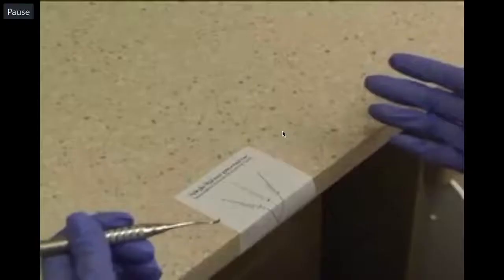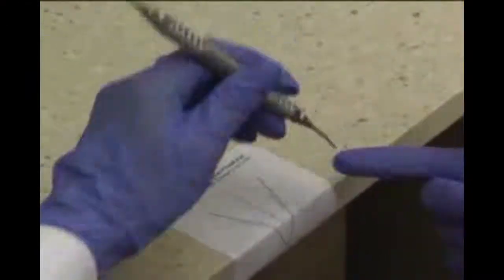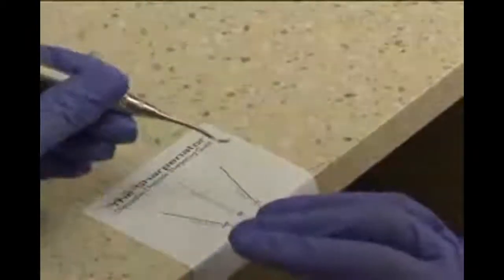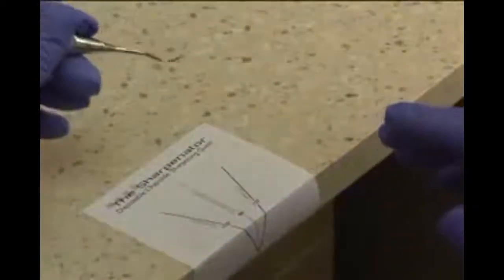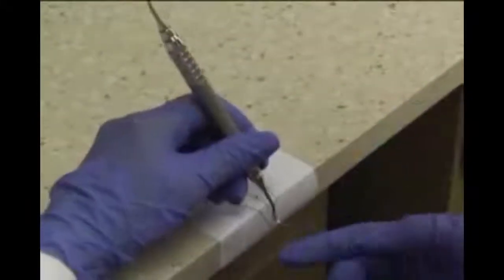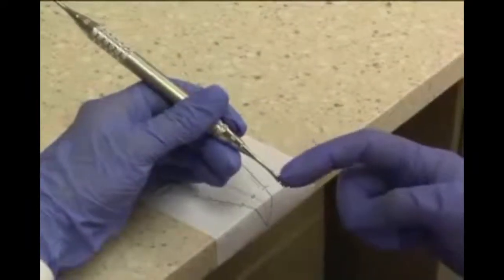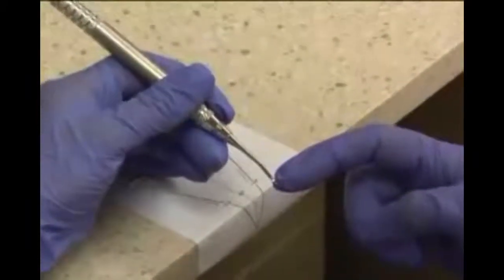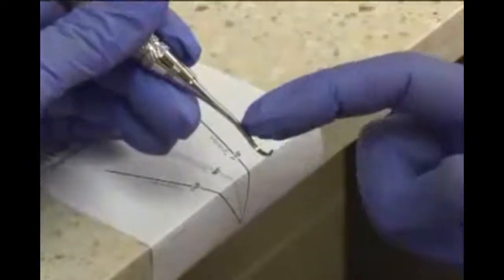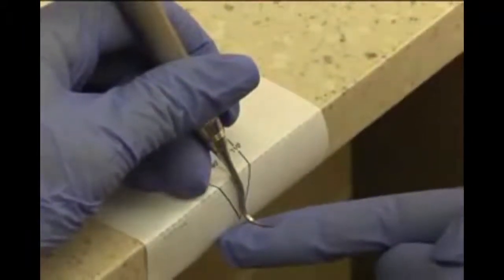So we are going to start with the anterior sickle. I'm going to make sure my arm is resting comfortably on the countertop. I'm going to hold the instrument in my non-dominant hand, and I will be positioning, this is an H6/7, so the terminal shank is this part here. It's where the blade ends to the first bend in the shank. So I'm going to put this terminal shank right here at the 90.